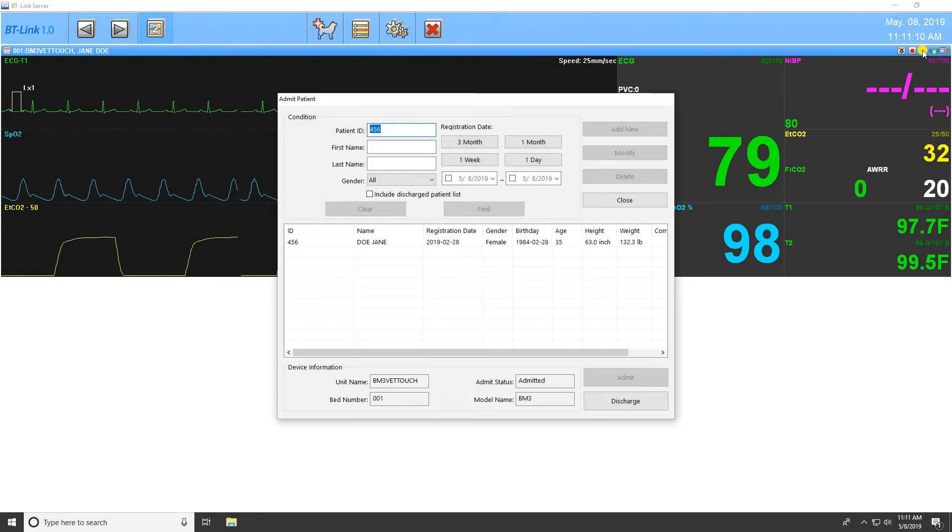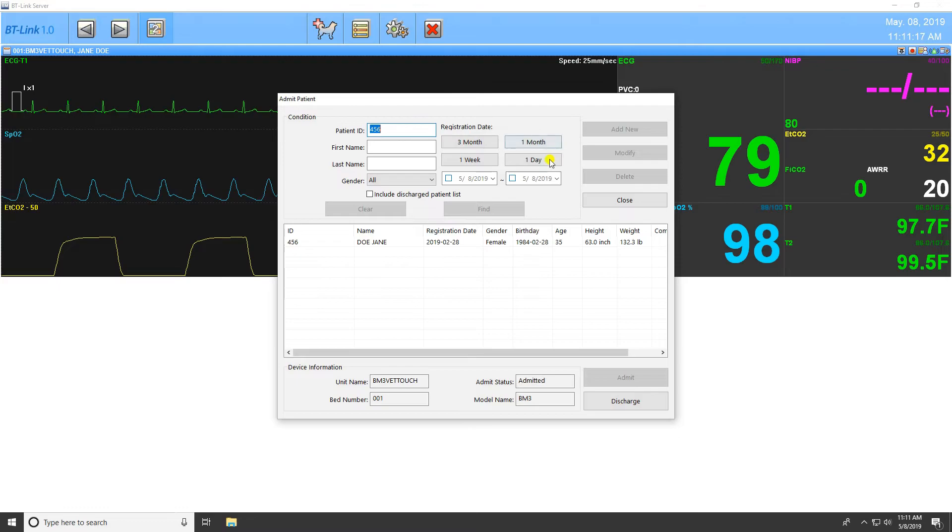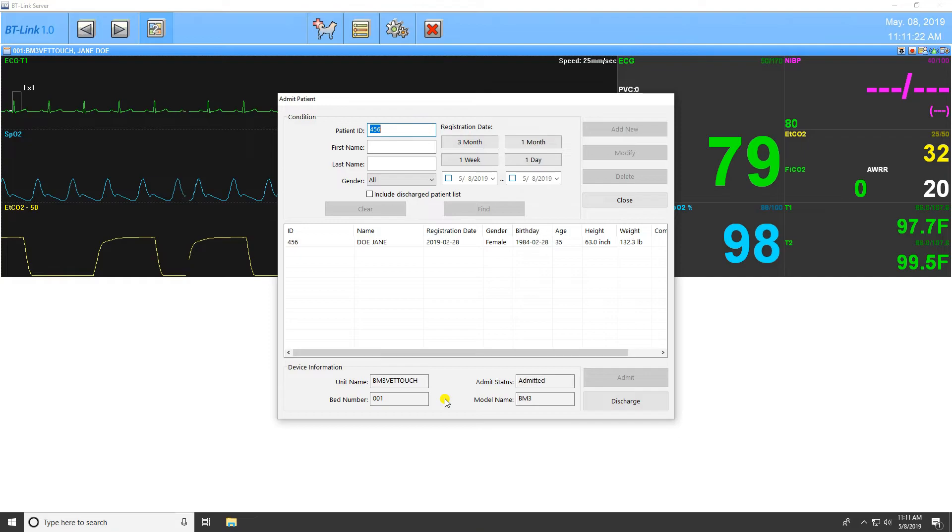The next icon is the Admit Patient function. This window will look very similar to the Patient Manager window from earlier. The functional differences with this window are the display of information from the patient monitor at the bottom of the window, and the ability to admit or discharge a patient directly from the patient's search results.